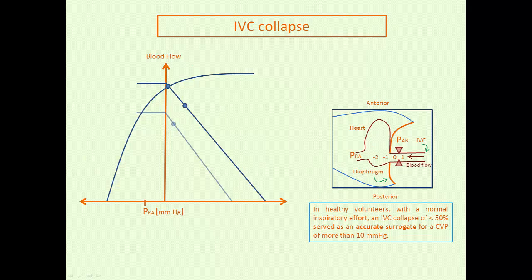So saying that again, in this patient, say the right atrial pressure at end expiration is, for argument's sake, 10. They make an inspiration. They drop the right atrial pressure here to say 2, but it's not quite enough to cause abdominal pressure to supersede the intraluminal pressure. So even though the right atrial pressure is decreasing, there's no significant collapse, or there might be just a smidgen of collapse as you approach this curvature here.